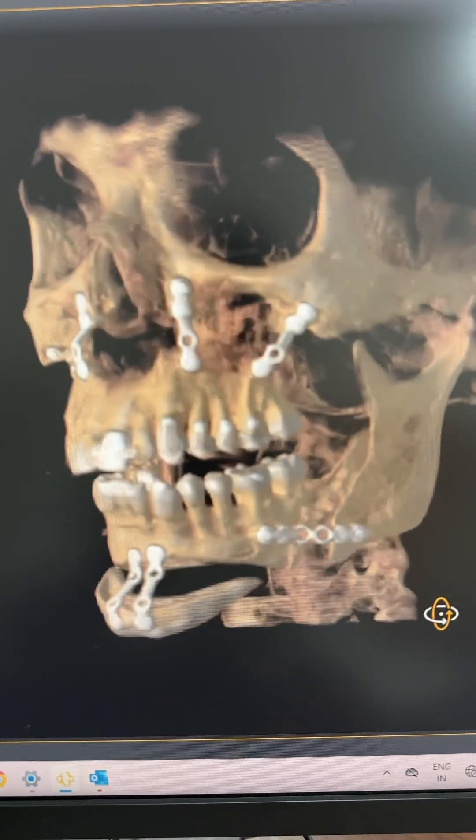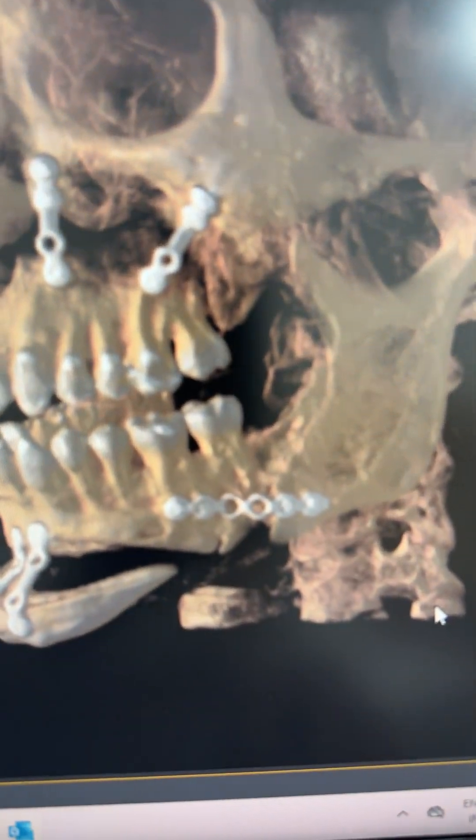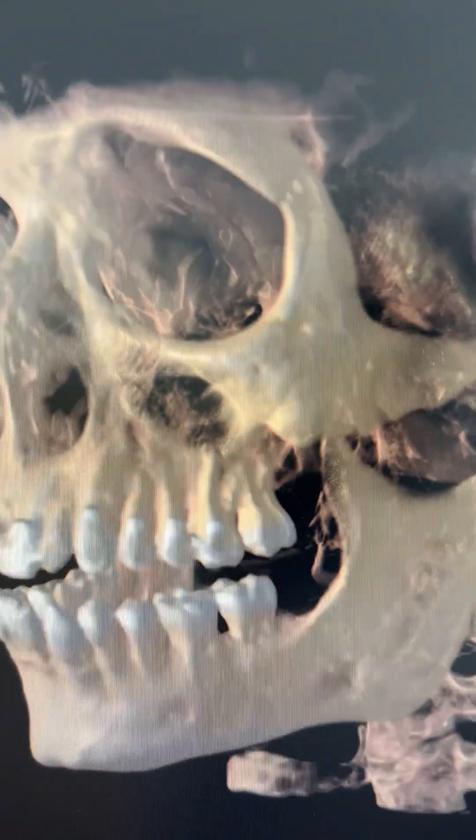So you can see here, I'm going to move it around to the left side. On the mandible, we've used a six-hole plate. The gap is more on the sagittal side; likewise, there is also movement on the upper jaw on the left side.